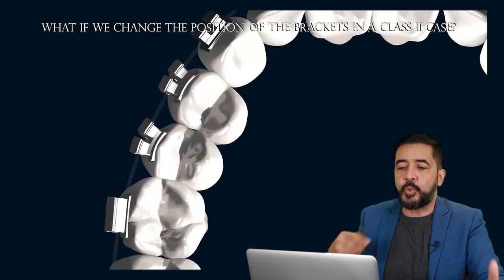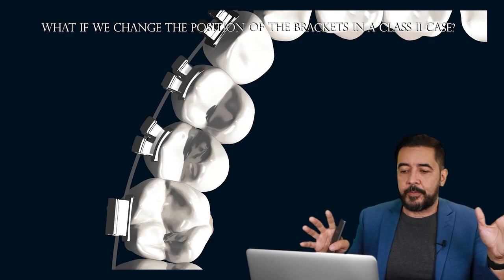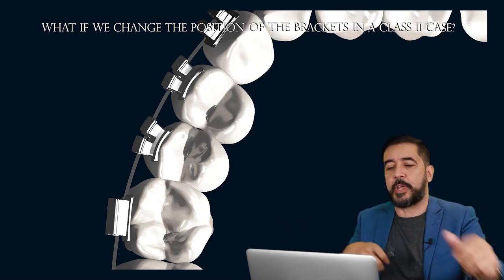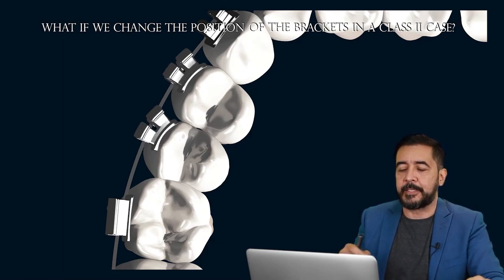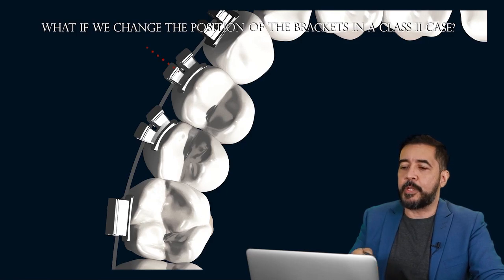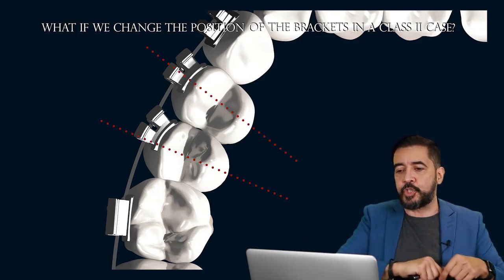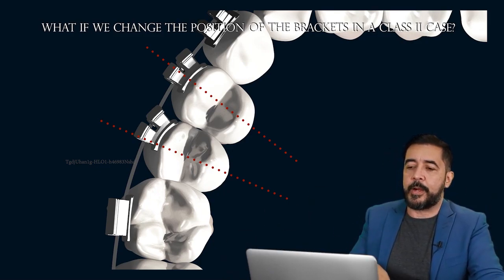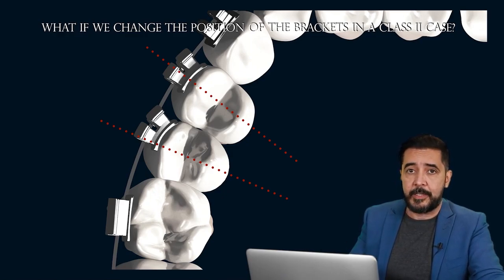So what do we do in order to, let's say, facilitate our intercuspation in a class 2 case? Think with me, if we just move the brackets medially in this situation, what will happen when we do this leveling of the arch, when we do this straightening of the arch wire? What will happen to those teeth where the bracket is not centralized? They will rotate. You saw that.